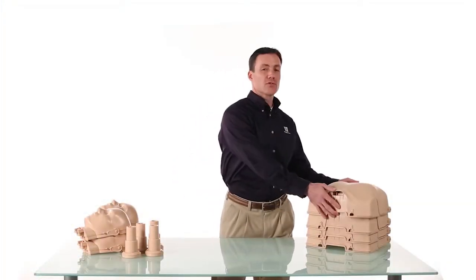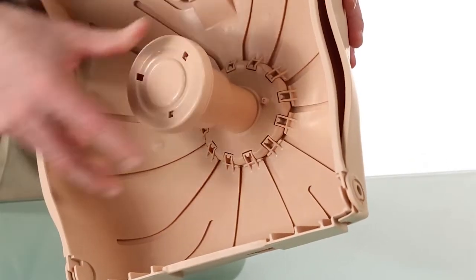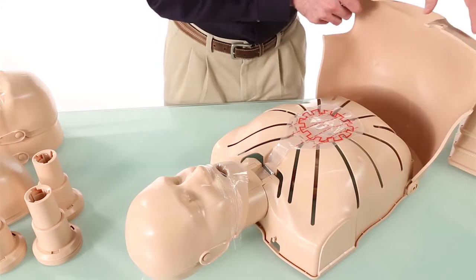Setup is fast and easy with no small pieces to lose or break. Simply attach the piston, assemble the head, insert the lung bag, and you're ready to train.